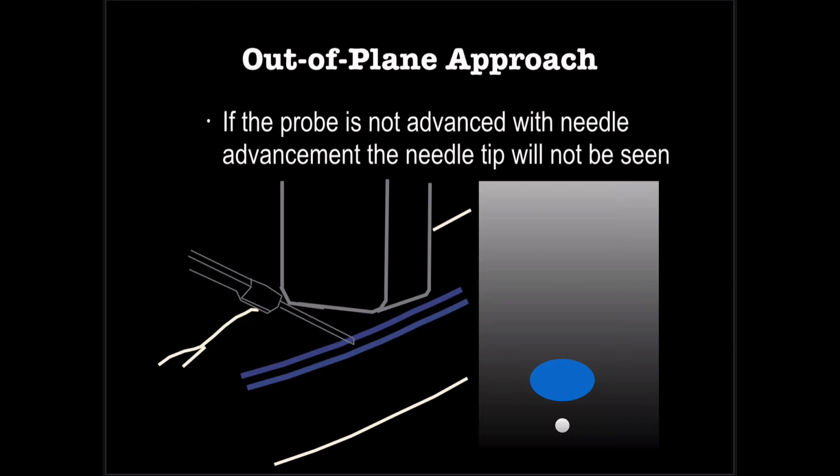Sometimes you'll get a good aspiration of blood and the carotid will be sitting back there and you get nice dark blood, but then you slip into the artery and then you forget, oh, I forgot to check again, and then you dilate the artery. And I saw that happen a few times a couple years ago. And then the patient gets a dissection. Remember, a dissection is a bad thing for a carotid artery because it causes strokes. That's a bad thing. So you don't want to do that. You want to make sure you know where your needle tip is.